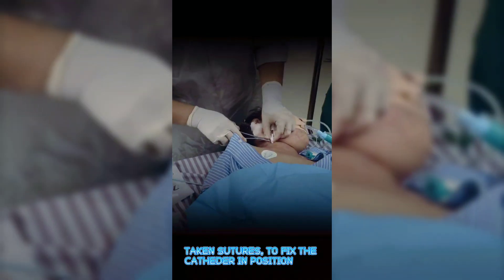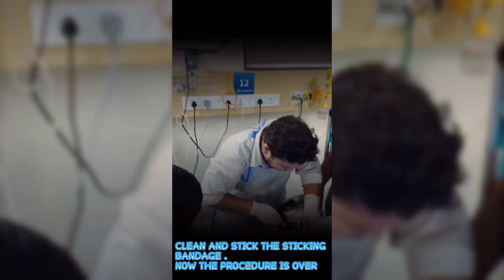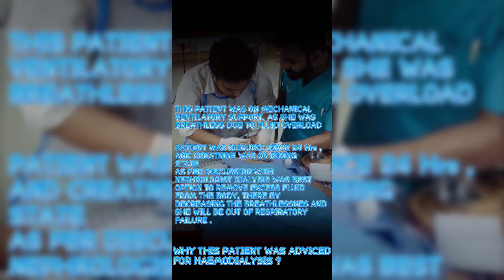Sutures are taken to fix the catheter securely in position. Clean the site and apply a sterile adhesive bandage. The procedure is now complete.